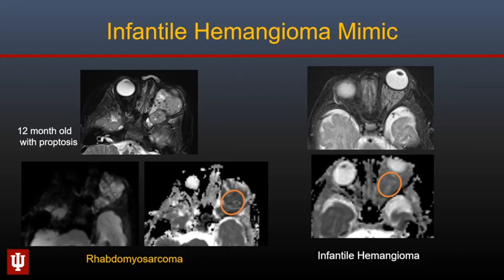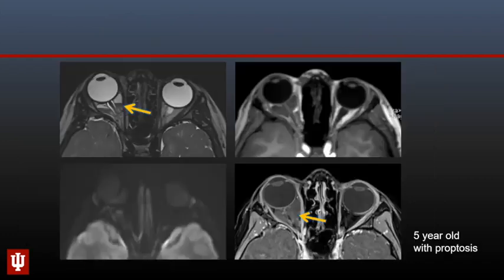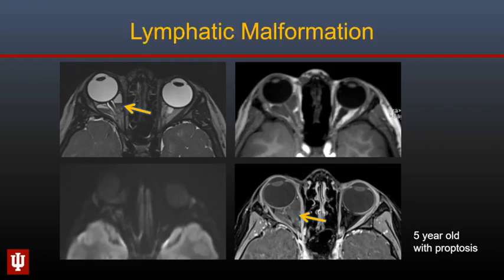One important mimic of infantile hemangioma is rhabdomyosarcoma, which can also occur in and around the orbit. These may be slightly more heterogeneous on T2-weighted imaging and characteristically are dark on ADC maps because they are small round blue cell hypercellular tumors. Here is another vascular abnormality in the orbit — a five-year-old with proptosis showing a lobulated intraconal lesion with fluid-fluid levels, no diffusion restriction, and minimal marginal enhancement, very characteristic of a low-flow vascular malformation such as lymphatic malformation.